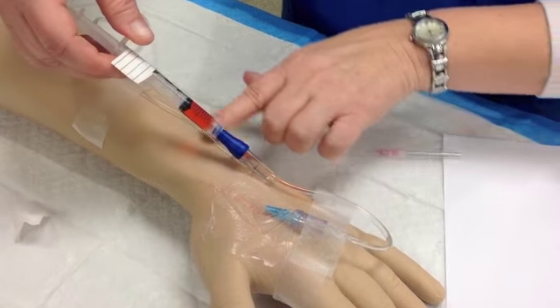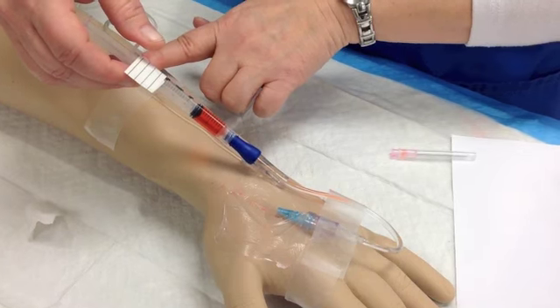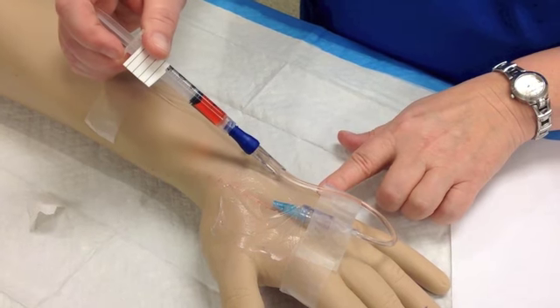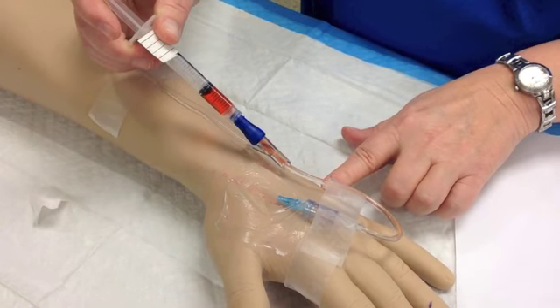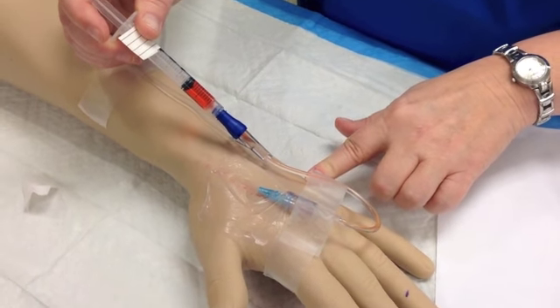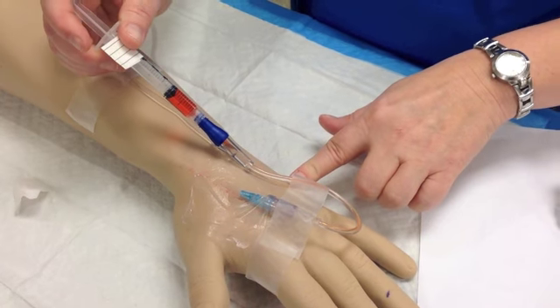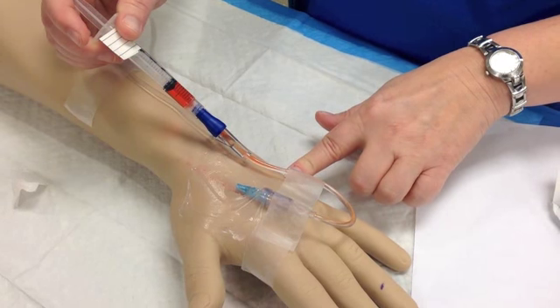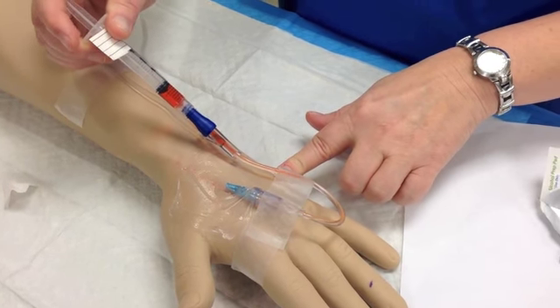And see, it's not backing up in my tubing. That was what I wanted to demo for you. It's actually going on into the patient's arm. So then I'm going to push 0.1 again. Wait 12 seconds. And for the sake of the video, we're going to advance this just a little bit. 0.1 again. Wait.